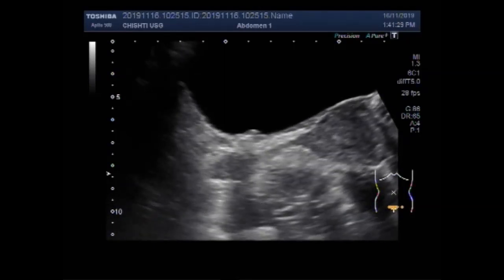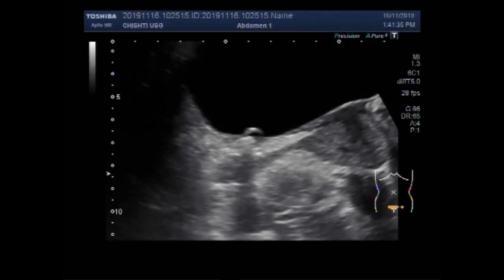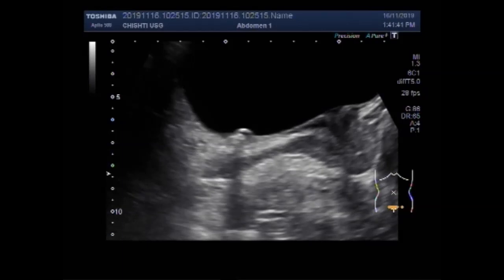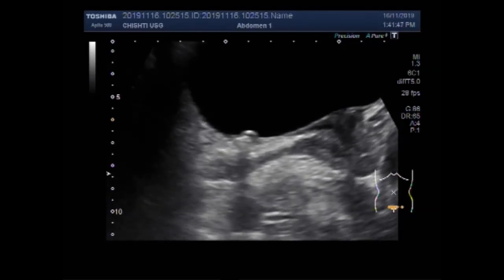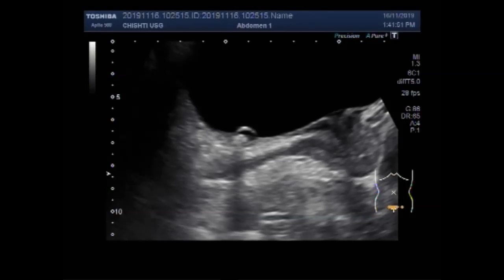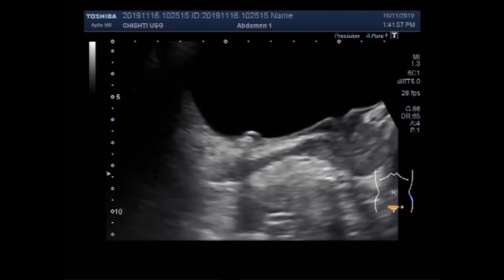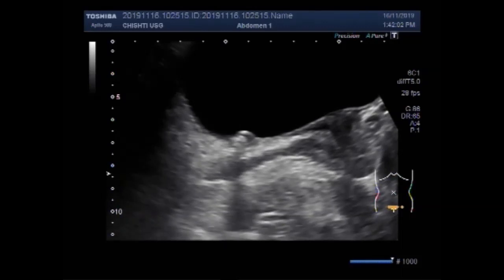Again you can see the dilatation of the ureter. This is the intravesicle or simple ureterocele. Again you can see the dilatation of the most distal portion of the ureter, and a stone is also seen near it.